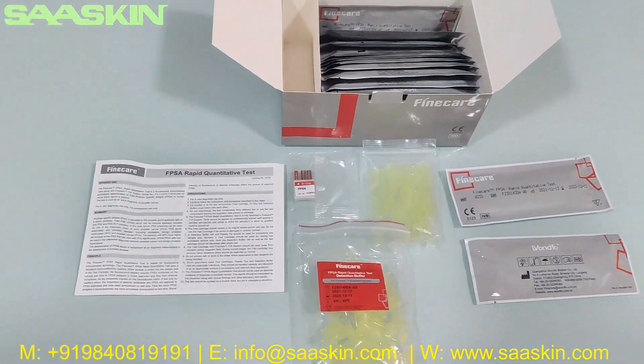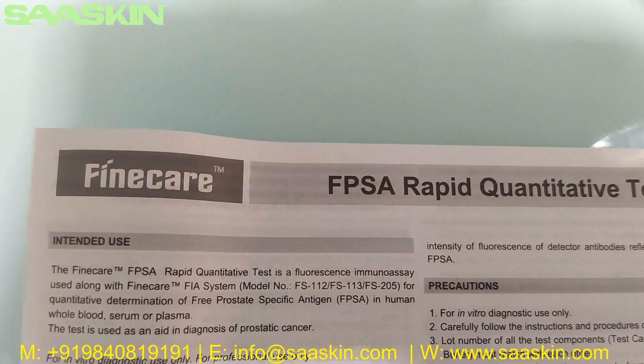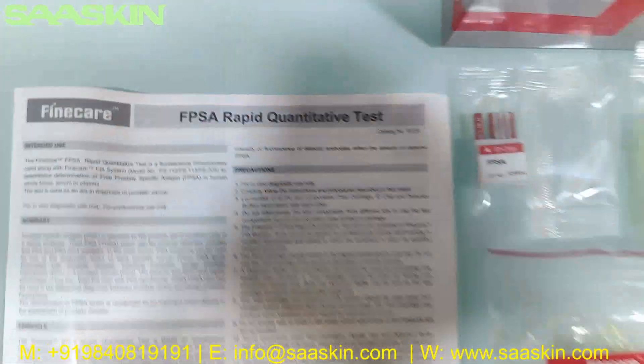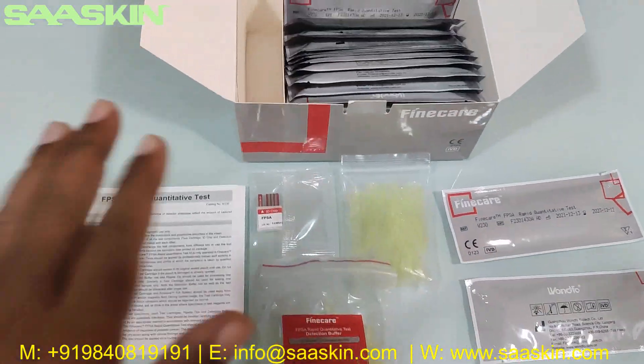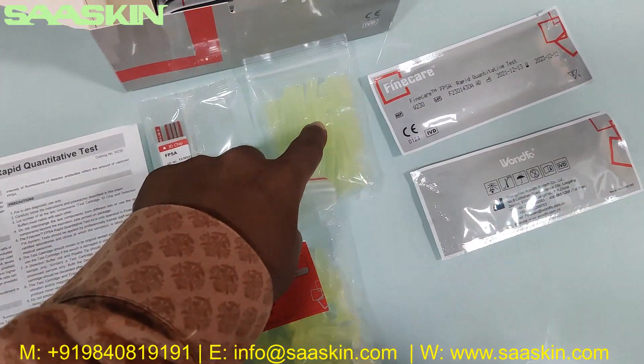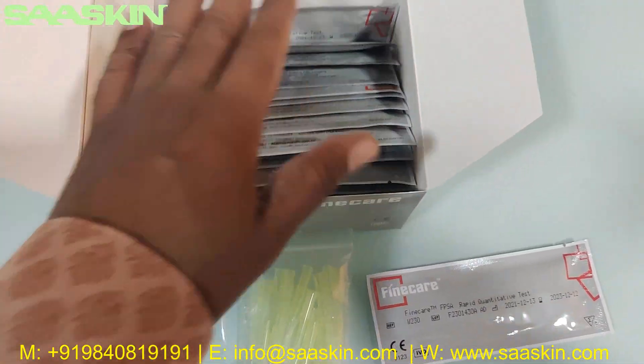This is how the total box content looks like. To quickly summarize, today we are seeing the unboxing of the FineCare FPSA Rapid Quantitative Test. In this 25 test kit box, you have one instruction for use manual, one ID chip, 25 pipette tips, 25 detection buffers, and 25 test cartridges.